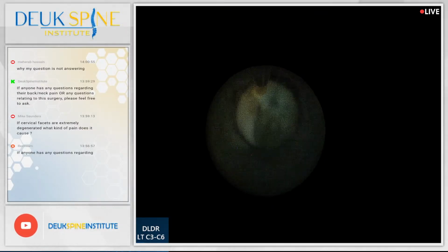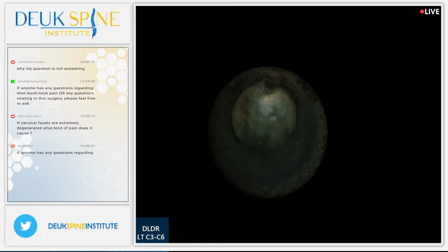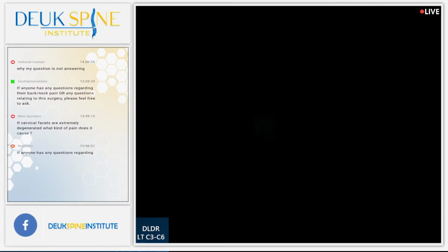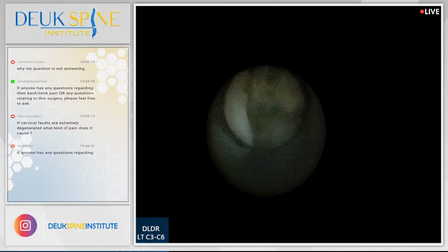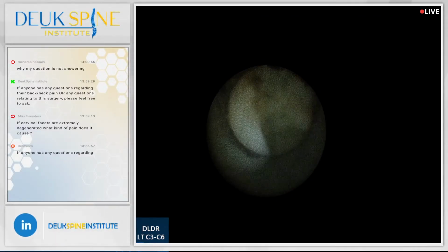A lot of herniation here. I've got to say, she has some of the biggest herniations I've seen in the neck. They're not just sticking out back big, they're also wide based. So it's like having not just a tall mountain, but a wide mountain too. A lot of dirt and rocks in a tall, wide mountain. That's what she has.